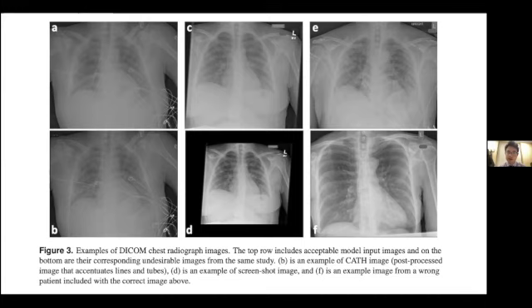And there are a lot of issues with that, and sometimes the best image may not be sent over, and so that is an ongoing problem. But at this point in time, we have the vast majority of the images that we want going over automatically. But regardless if this is for MRIs of the brain for someone who has a stroke, or fractures of the foot, for some fracture detection model, whatever the AI model, the series selection problem can be very challenging, and it may differ from institution to institution.